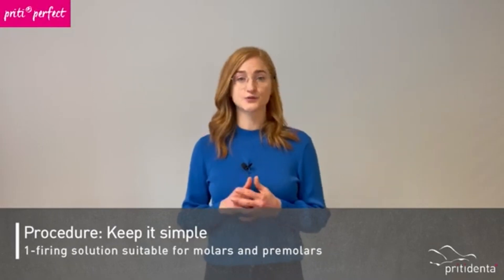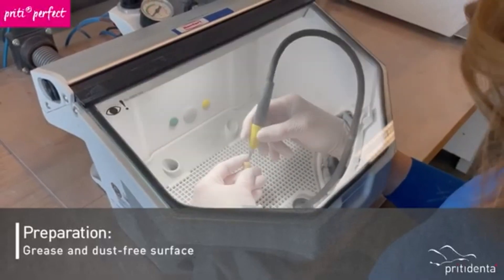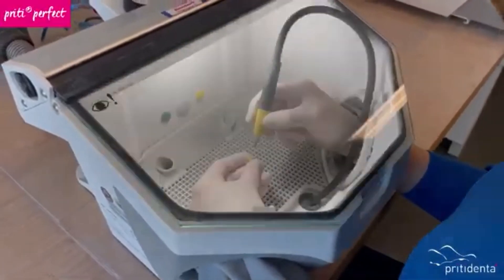This one firing solution is particularly suitable for molars and pre-molars, for example in areas where an individualized effect is required with minimal effort. The surface of the crown should be grease and dust free. You can achieve this by carefully sandblasting the surface with 50 microns aluminium oxide or by cleaning in an ultrasonic bath.